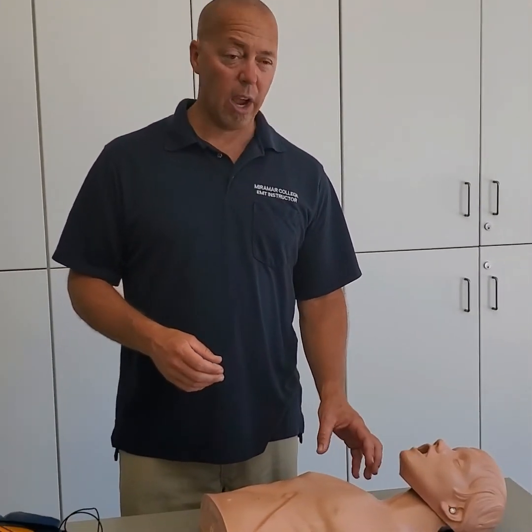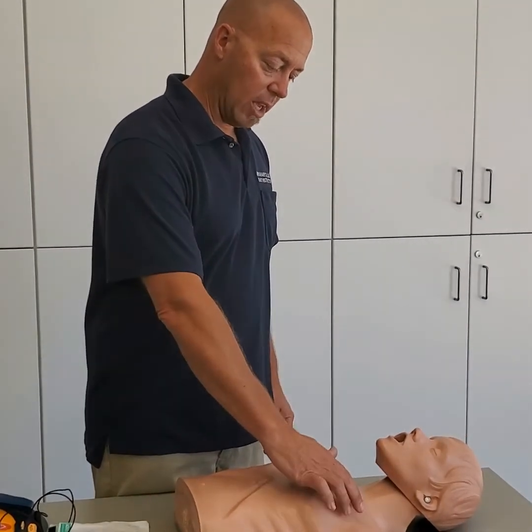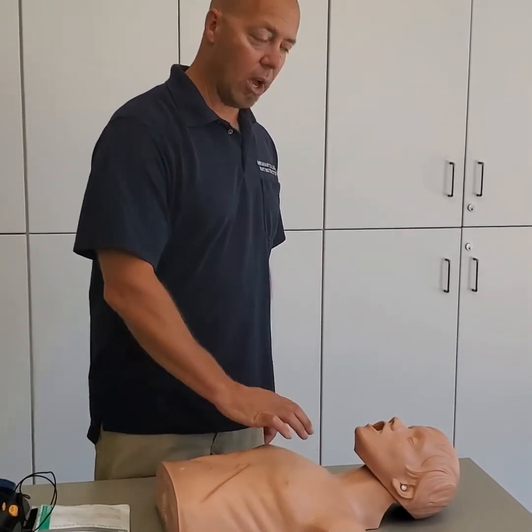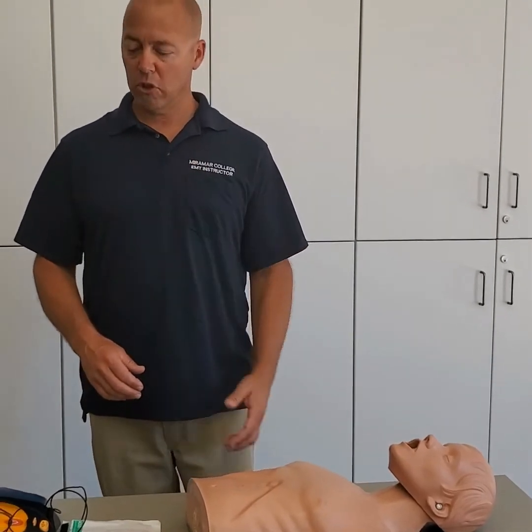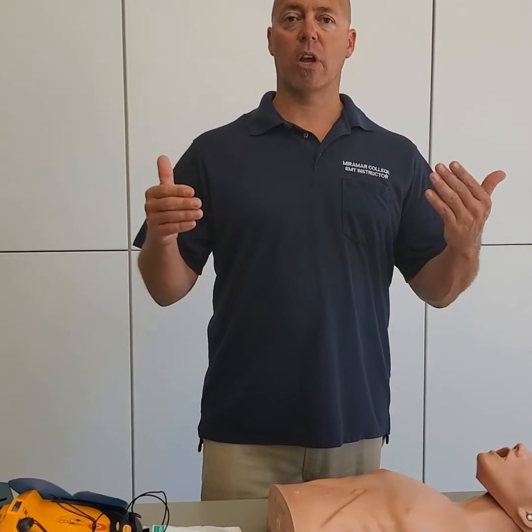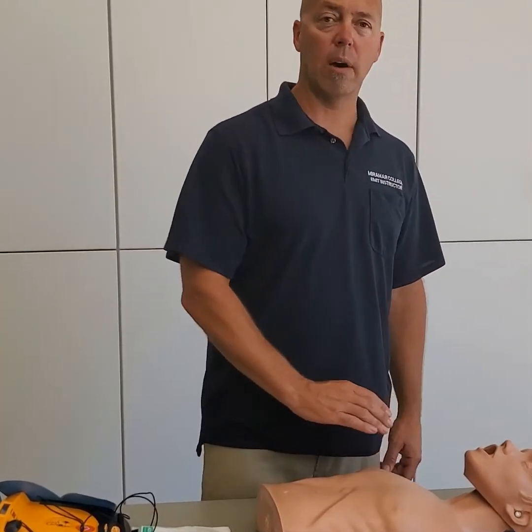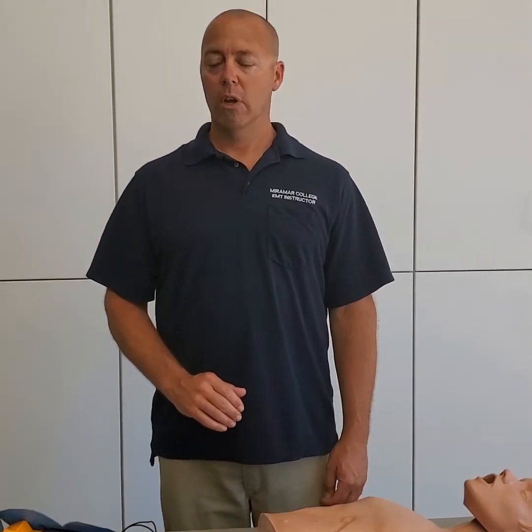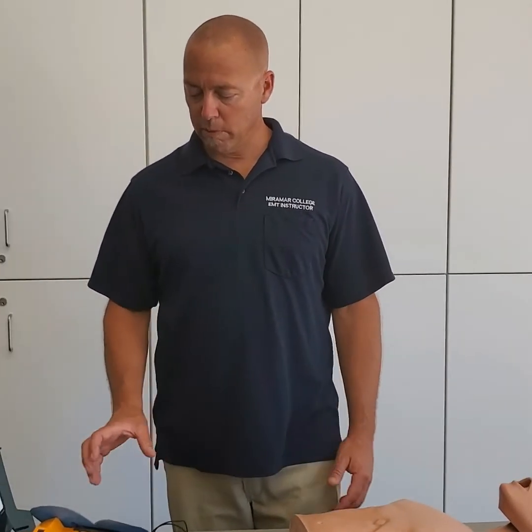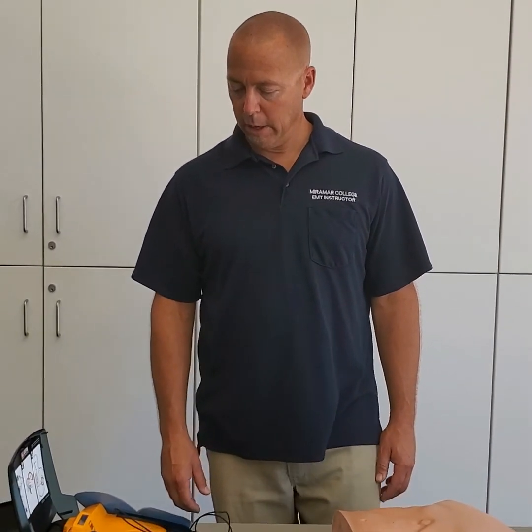If we have any transdermal patches on the skin, so medication patches, assuming we have our PPE and standard precautions on, we would take off those patches and wipe off all the excess medication. Those are the things we want to do before we apply the AED.